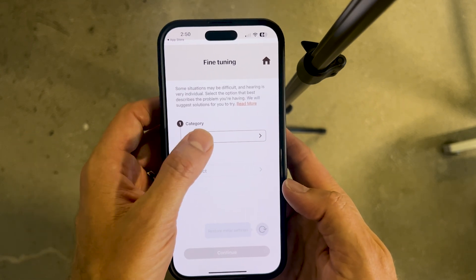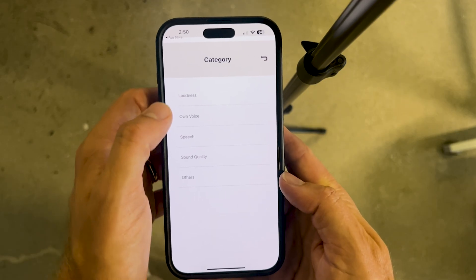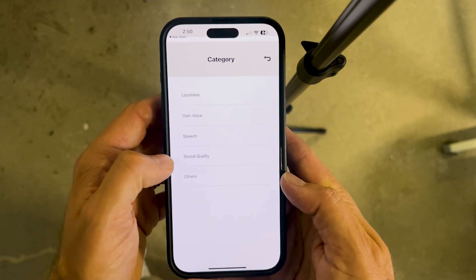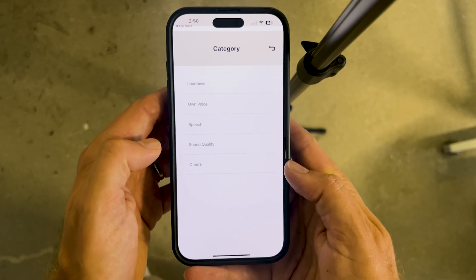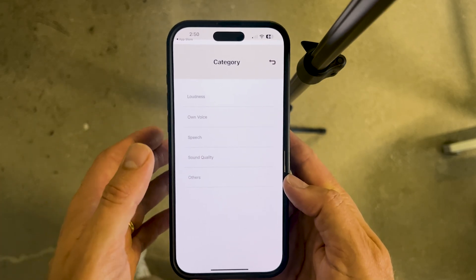The first thing to look at is the category. There are five different categories you can choose from: loudness, own voice, speech, sound quality, and others — which is simply feedback management. Depending on what you're experiencing, you'll want to pick a category that makes sense.